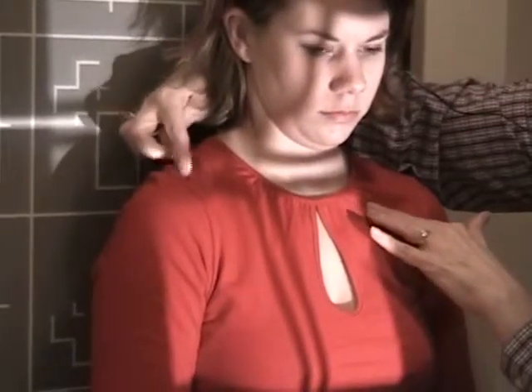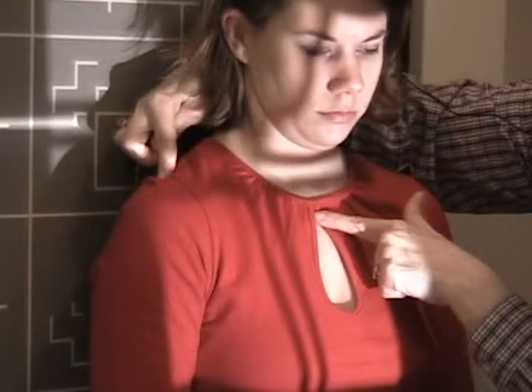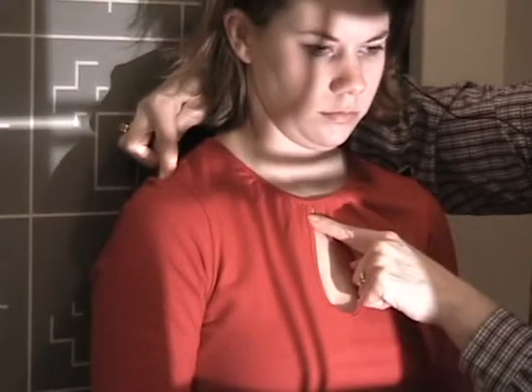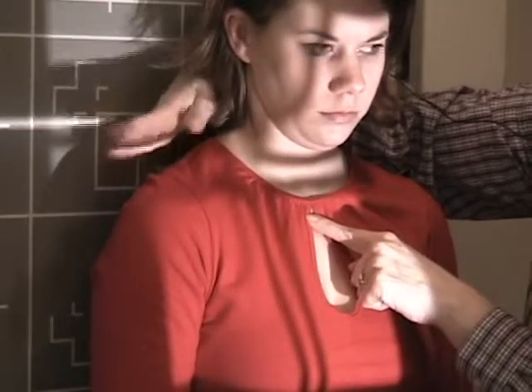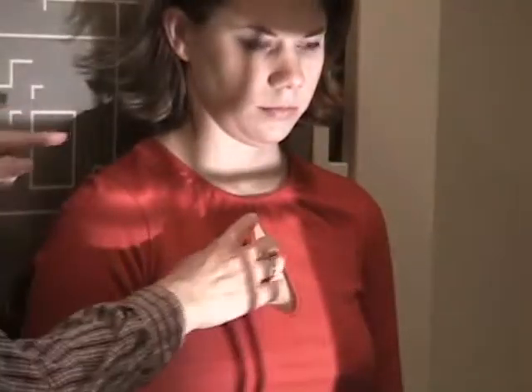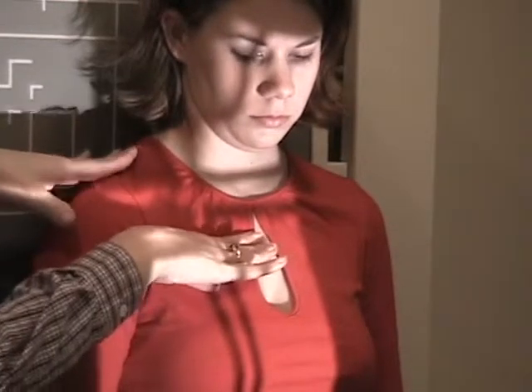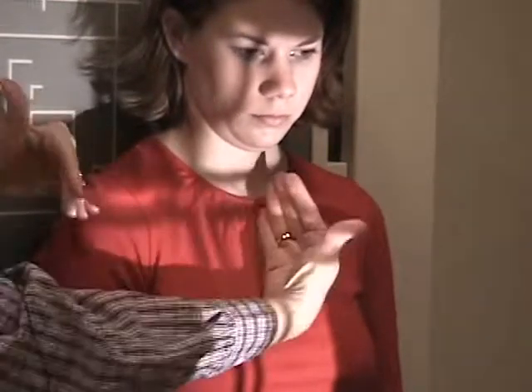Okay. Here's the top part of the clavicle, the superior portion right at the AC joint, and there's the lower portion of the clavicle. So if you look at this crosshair here, can you see that it's a little high? It's leaning towards the superior aspect of the shoulder. So I need to lower the tube down a little bit. Okay. There's the bottom of the clavicle, there's the top. Can you see now that this crosshair is coming right down between my two fingers, these two planes? So I've centered the clavicle this way, and I've centered the clavicle this way.